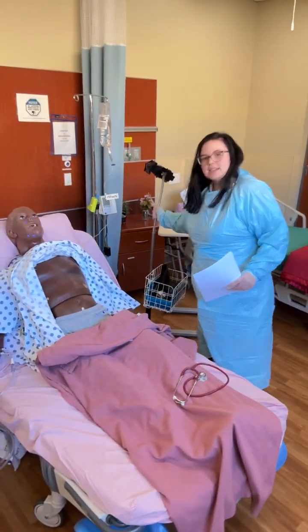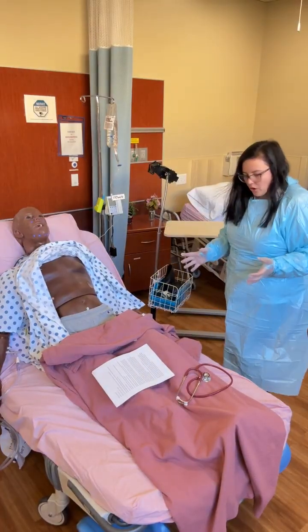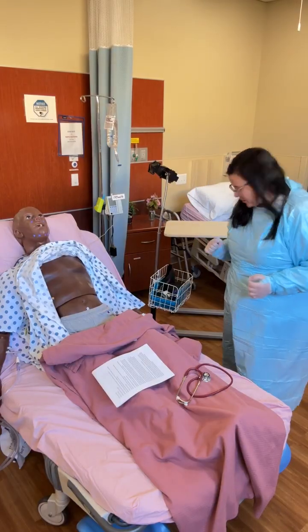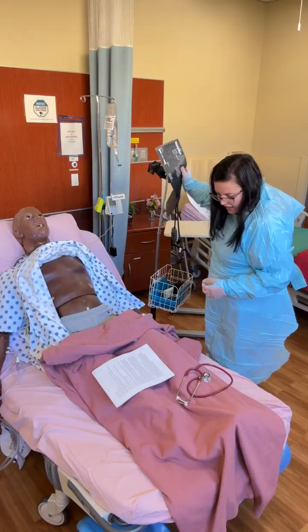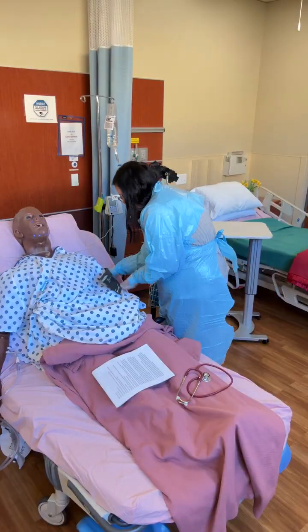Remember, we always stand on this side of the bed just so that the sim staff and instructors can see what we're doing. And then you're going to actually go through the motions. So this would be an example of what you do not want to do in the isolation room. But if you need a blood pressure, you are going to put it on your patient's arm.